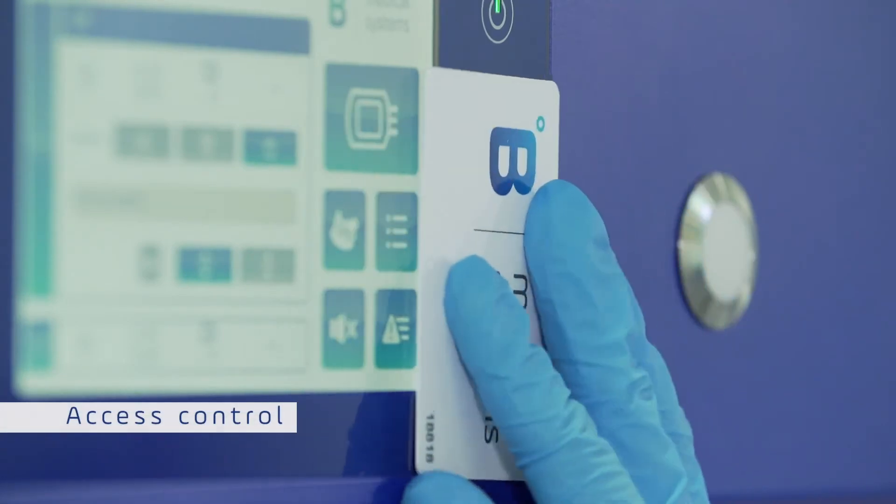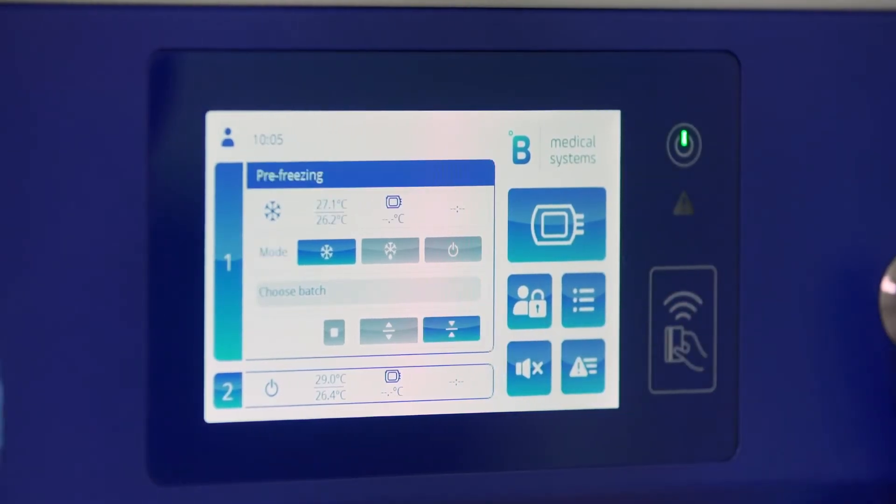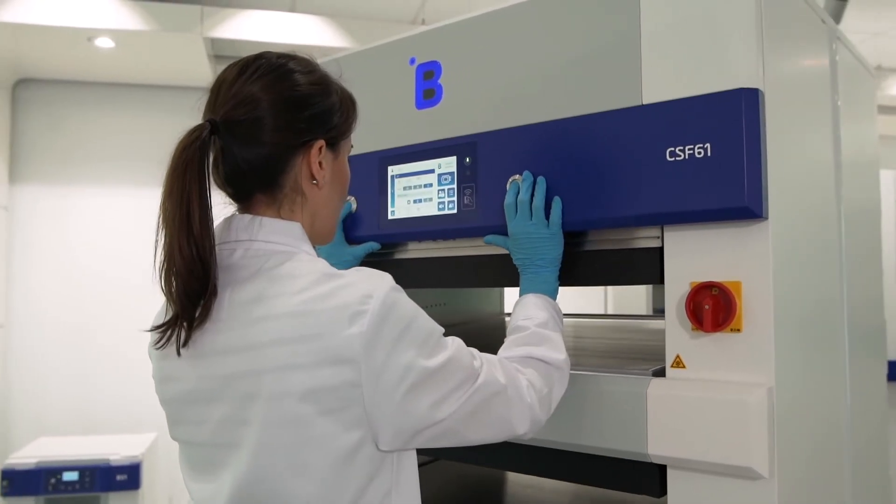Log in with your badge or password and start the pre-cooling of the freezing plates. Remember to press both buttons simultaneously.